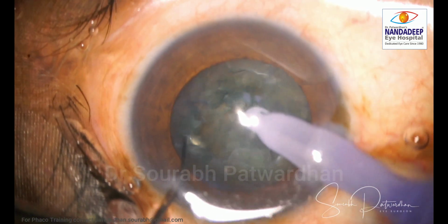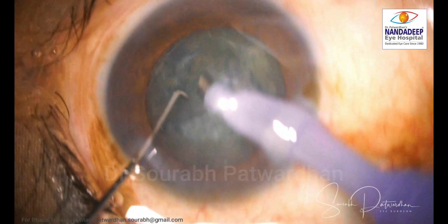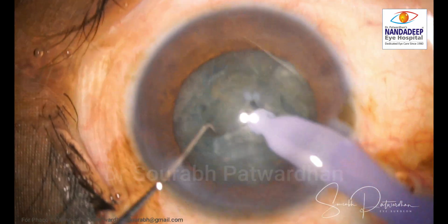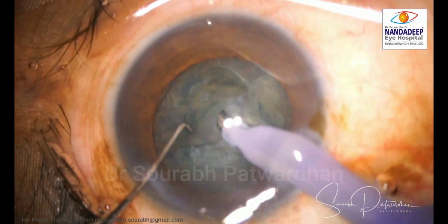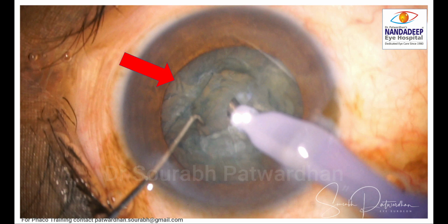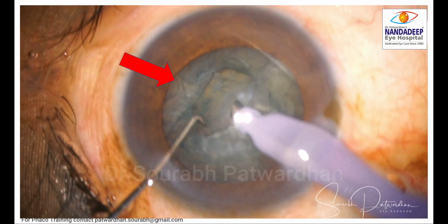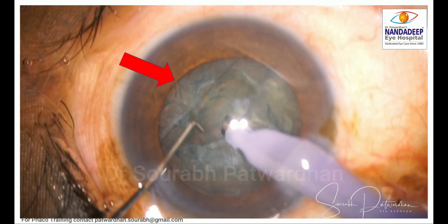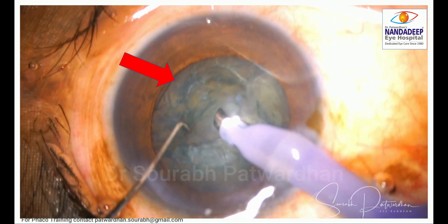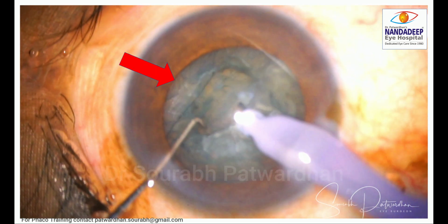And then I realized there was an additional membrane. You can see now it started coming from the left top angle. You can see this. I call it posterior ledge. So once it started coming, I definitely thought that something is unusual. We never see this kind of membrane. So something was not good.